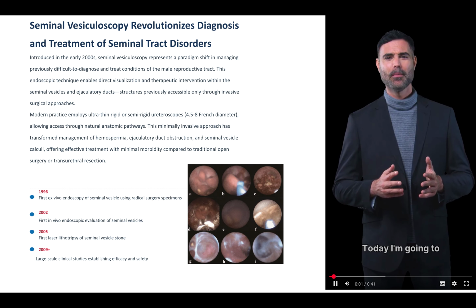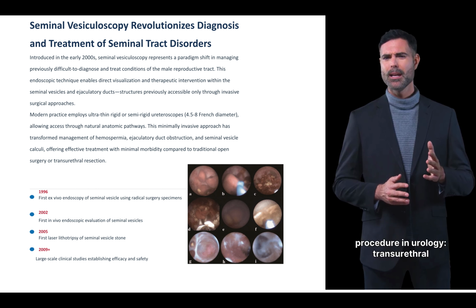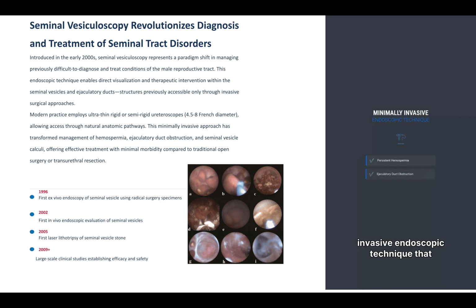Good morning, everyone. Today I'm going to introduce you to a fascinating and increasingly important procedure in urology, transurethral seminal vesiculoscopy, or TUSV. This is a minimally invasive endoscopic technique that has revolutionized how we manage persistent hemospermia, ejaculatory duct obstruction, and other seminal tract disorders.